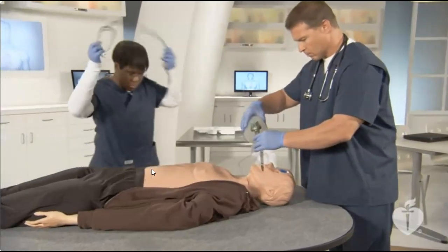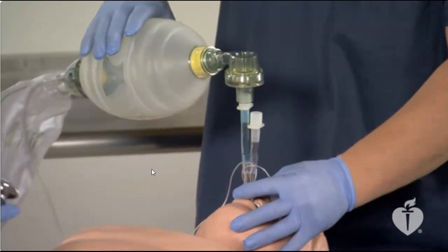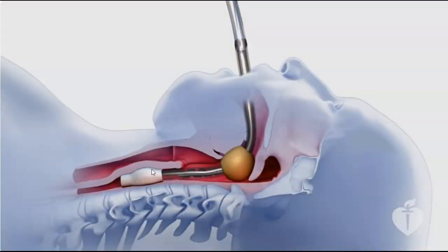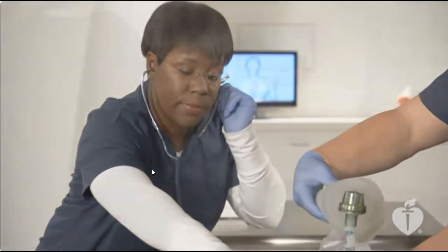Begin ventilation through blue lumen number 1, checking for adequate breath sounds over both sides of the chest and over the epigastric area. Watch for chest rise. If the esophageal tracheal tube is correctly seated in the esophagus, you should hear no sounds in the epigastric area when you squeeze the bag mask device.